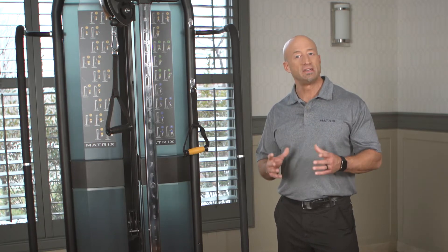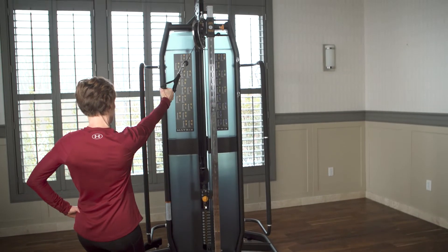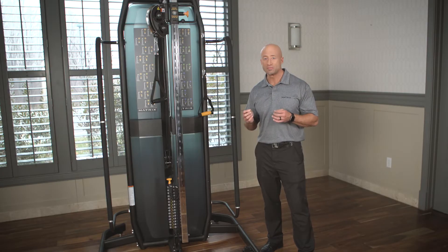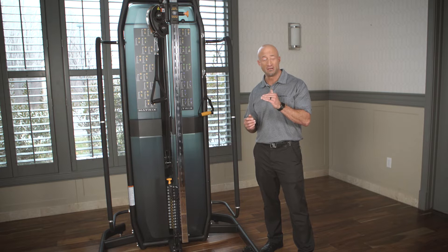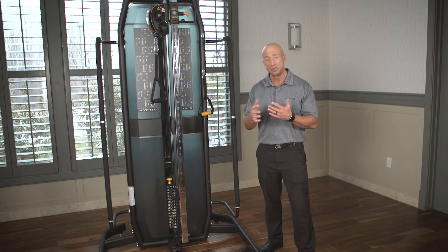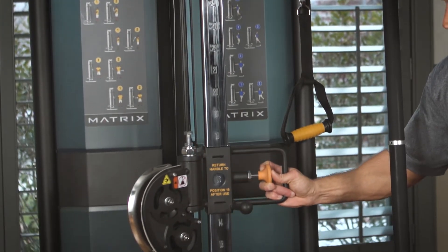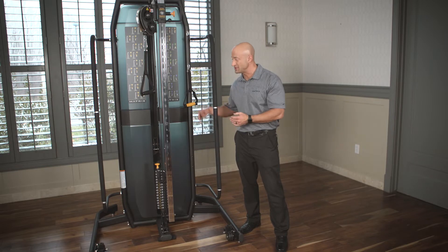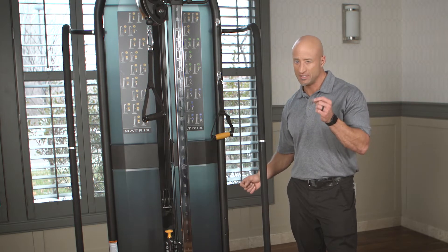What makes this one different from what else is out there is that it's a standalone single adjustable column. Second, it has more adjustment points to allow you to put the cable at a particular height for a predetermined exercise. For example, if you're going to do a chest press or external and internal rotation, you're able to align the pulley exit at exactly where you need. There are 35 different positions all up and down the ROM tube, which allows you to dial in a specific height.